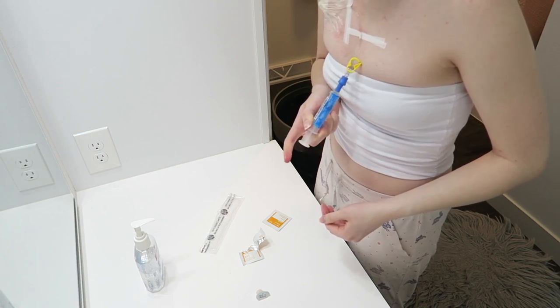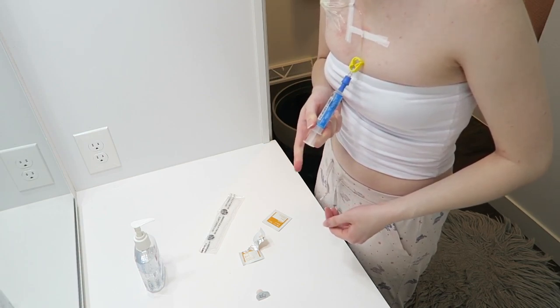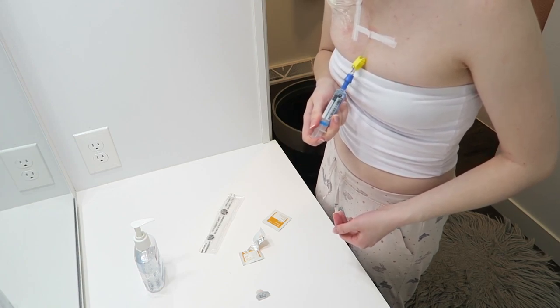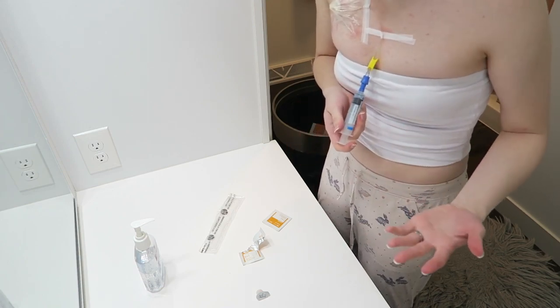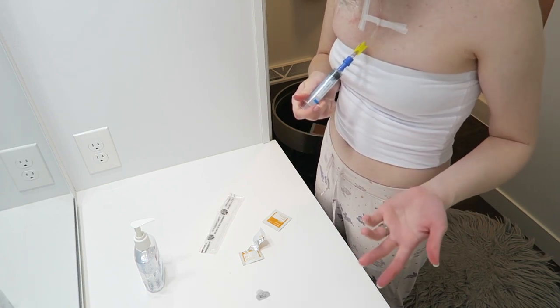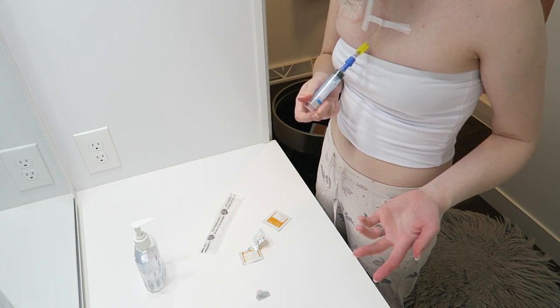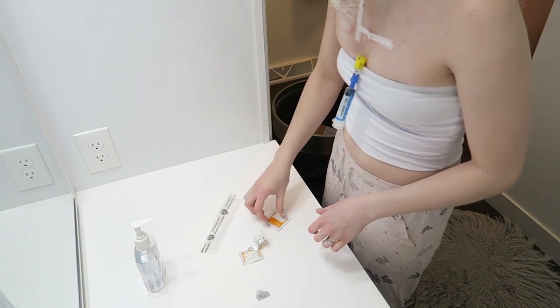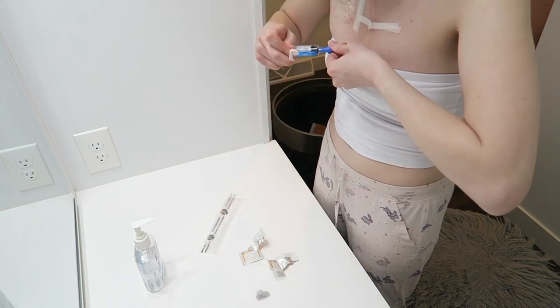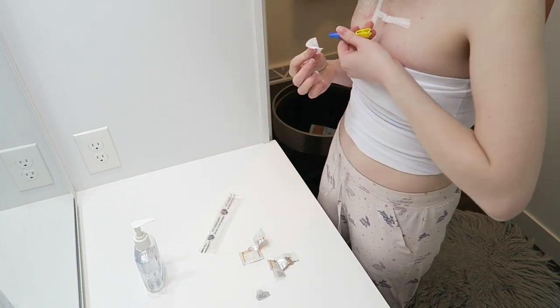You're gonna push, pause, push, pause, push, pause, push, pause. That just helps break up any clots that could potentially be forming in your port. Again, I just got perfect blood return, so that's probably not the case, but it's always good to do that. Next, you're going to open your other alcohol pad and you are going to clean the end of your line.